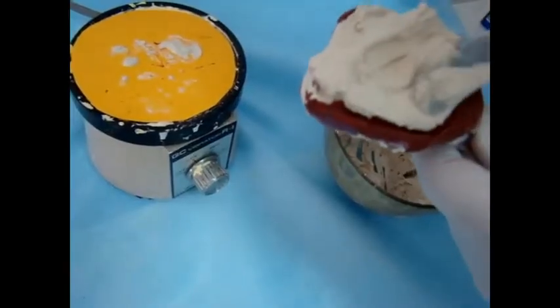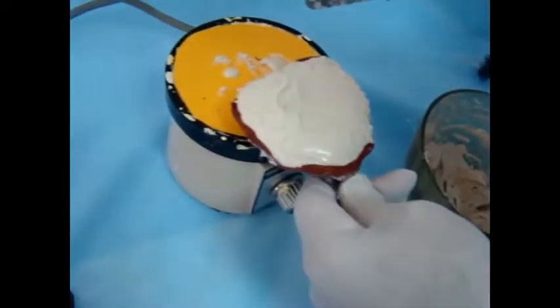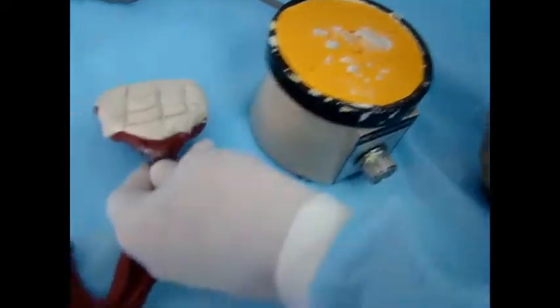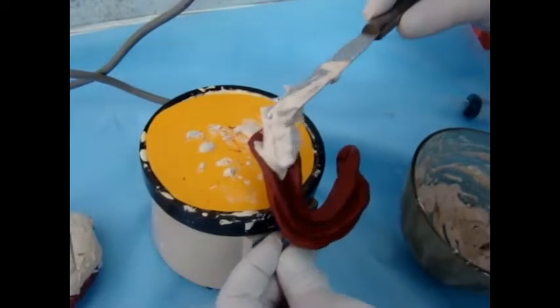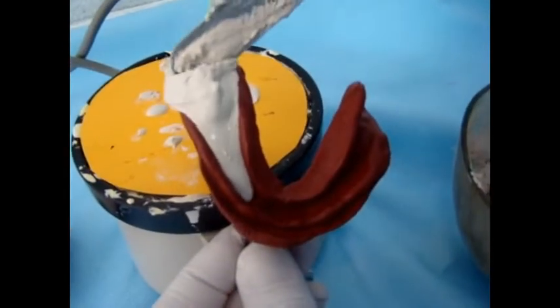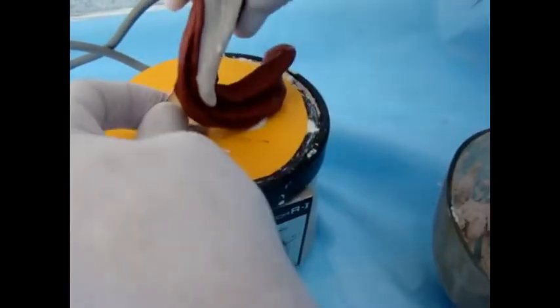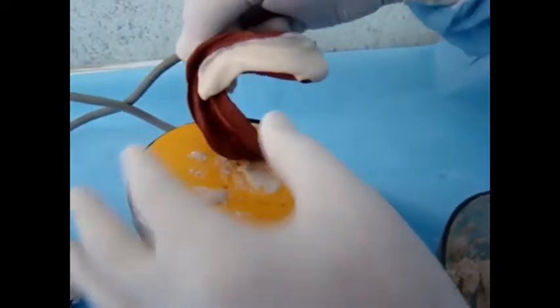By this we make sure that all air bubbles are excluded from the surface of the impression. Then the second pour is added — the impression is fully covered with plaster of Paris and some retention or indentation grooves are made on the top of the second pour.